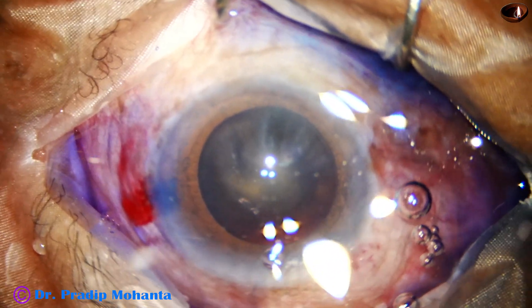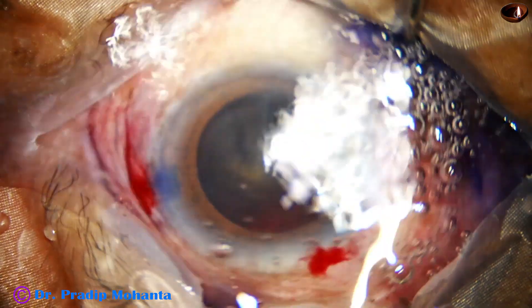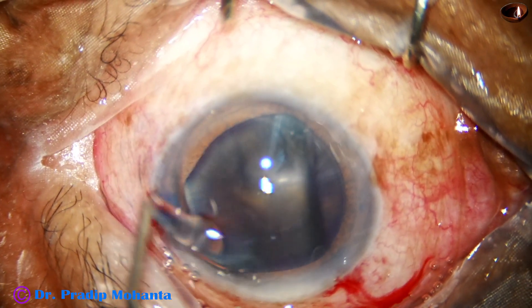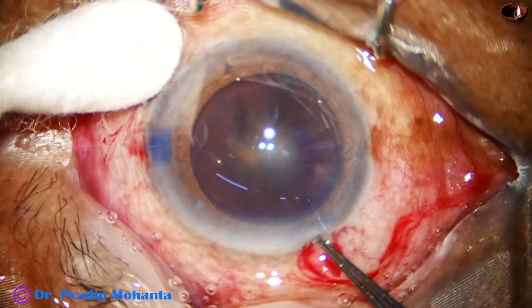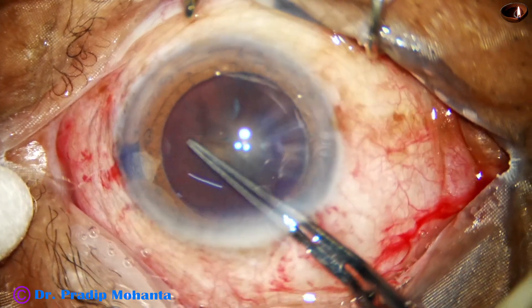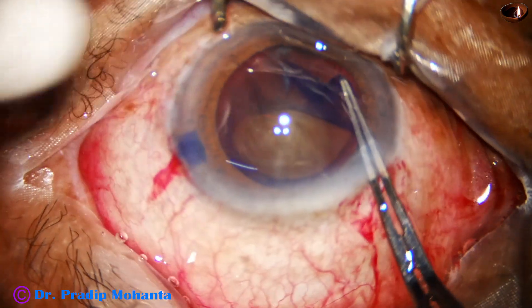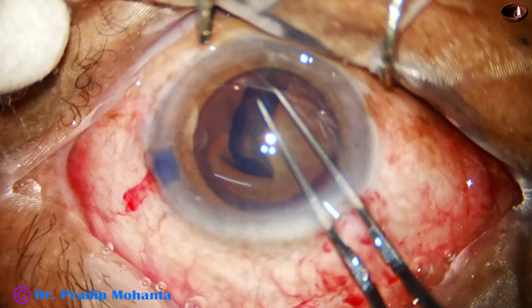I use utrata forceps to do capsulorhexis. Before that, the anterior surface of the cornea is washed out and viscoelastic is applied over the cornea. Here goes the utrata forceps. A capsular tag is raised and this capsular tag is guided anti-clockwise all around to get an adequate size rhexis of about 5.75 millimeter.